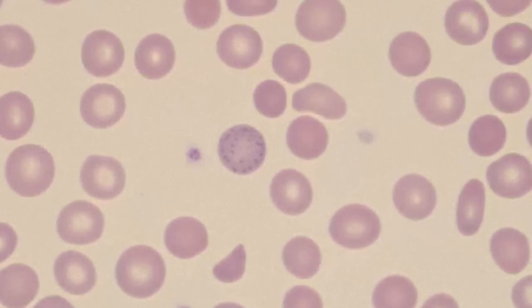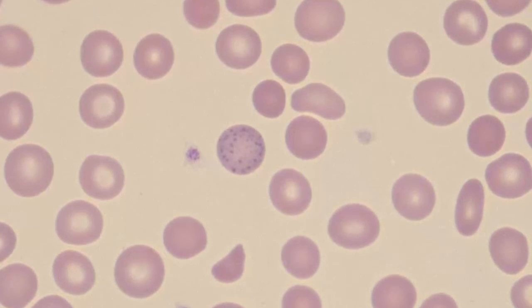All right, this slide we are going to focus on, no pun intended, basophilic stippling. So stippling is a red cell inclusion. I've also made a couple of other videos on Pappenheimer bodies and Howell-Jolly bodies.